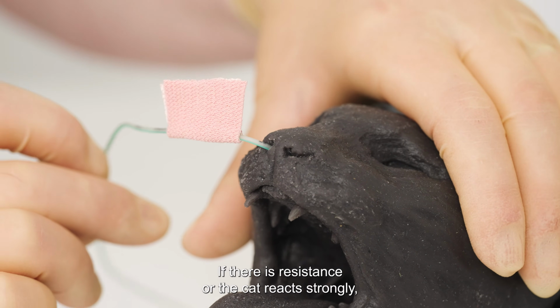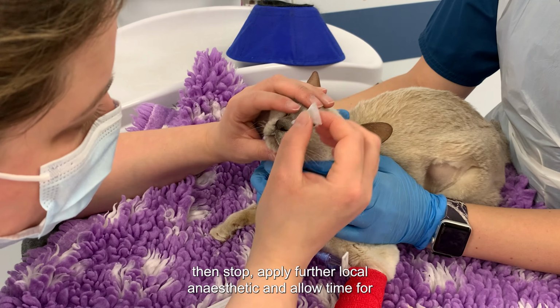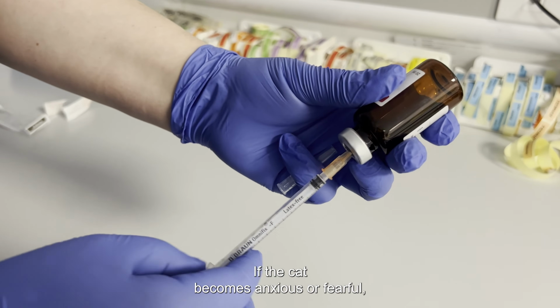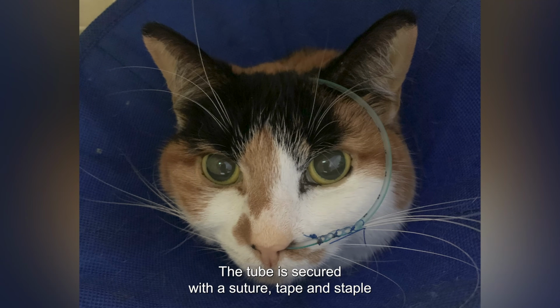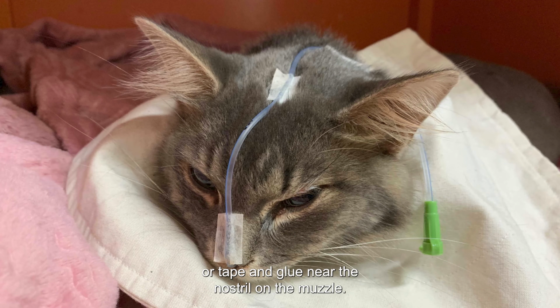If there is resistance or the cat reacts strongly, then stop, apply further local anaesthetic and allow time for effect before trying again. If the cat becomes anxious or fearful, consider further sedation. The tube is passed to the level of the tape or marker. The tube is secured with a suture, tape and staple, or tape and glue near the nostril on the muzzle.